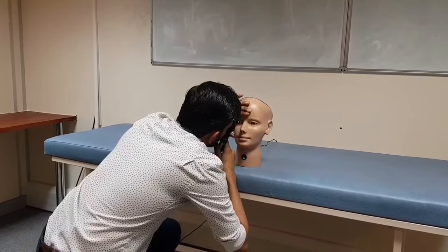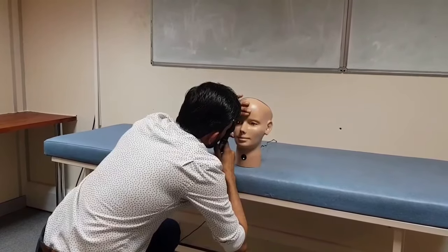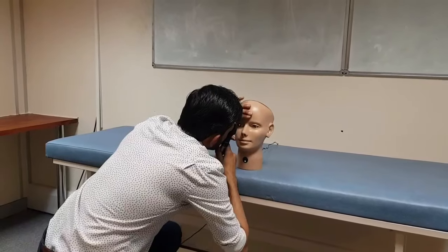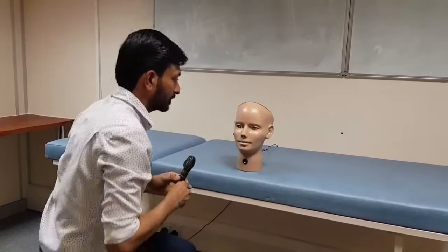My most probable diagnosis is normal fundus. Now I'll be examining the other eye.